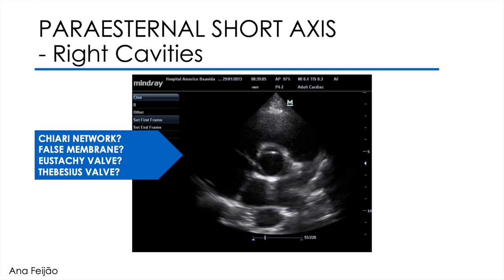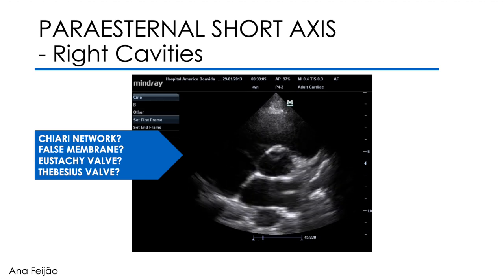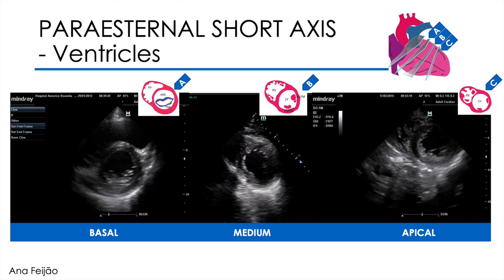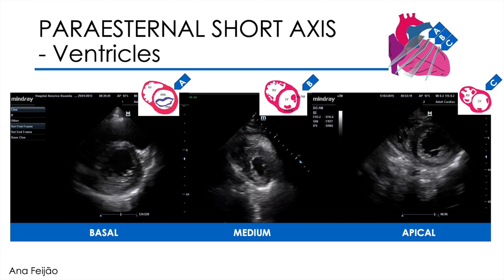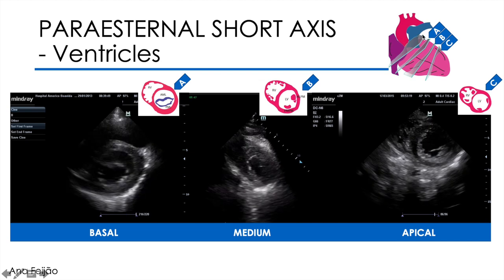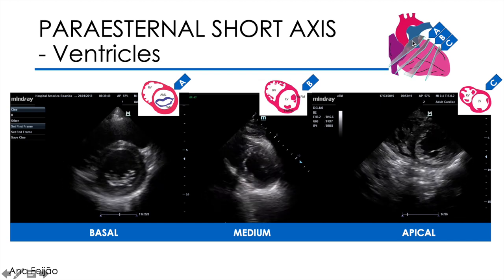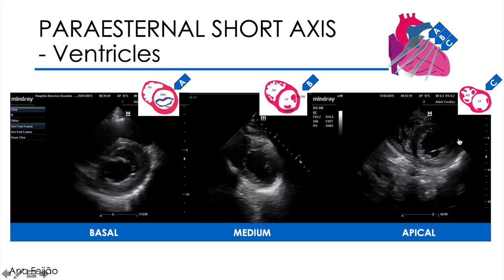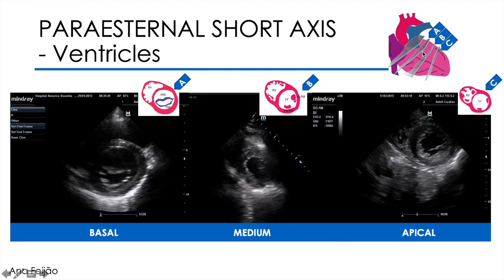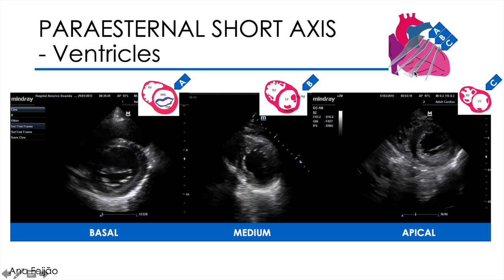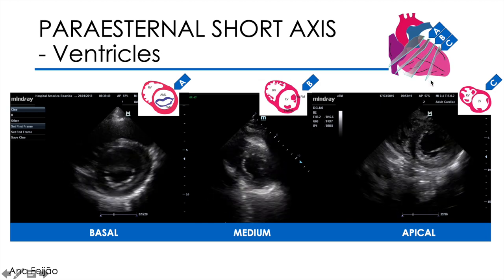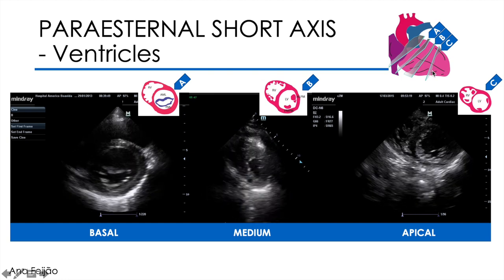We move on to the other parasternal short axis cuts. The parasternal short axis view is based on views resulting from cross sections of the heart, as if we cut the heart into slices. The slice at the level of the great vessels is the one that takes the most work in terms of evaluation. Scanning through the other levels, the evaluation is more subjective and faster. This sweep is done with small tilts of the probe, scanning from the upper basal level in A to the apical tip — lower level — here in C.